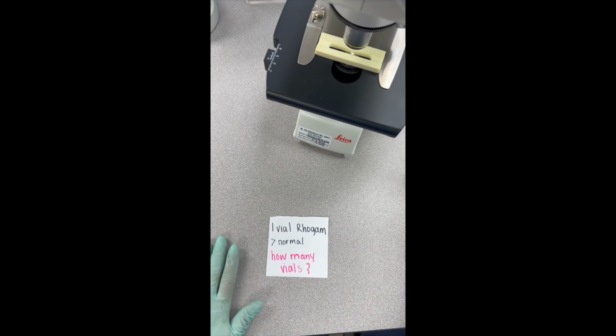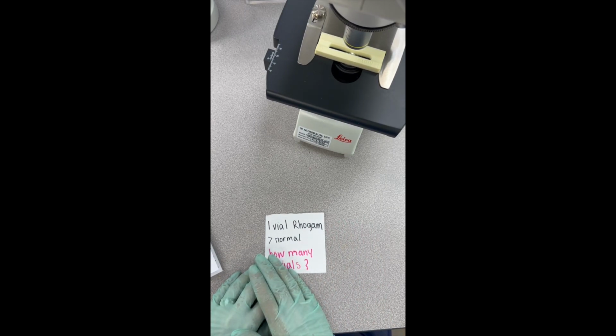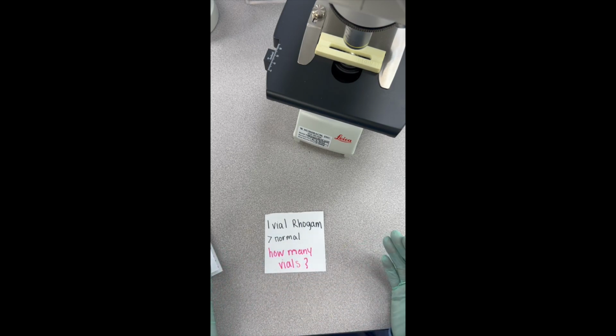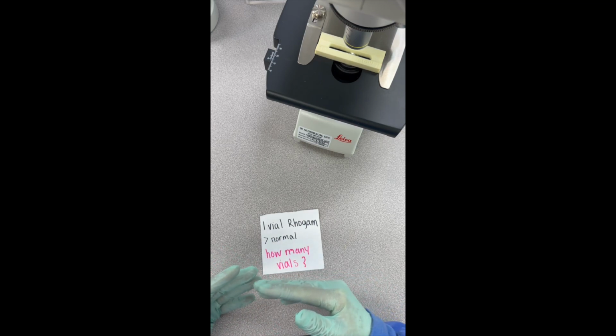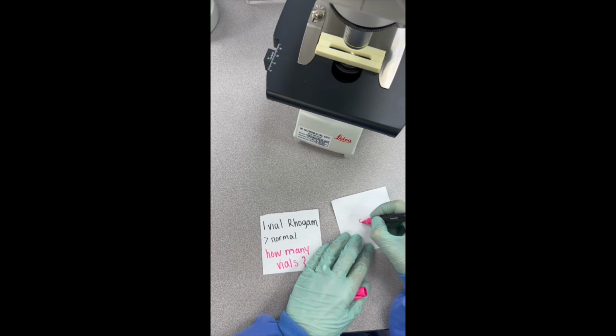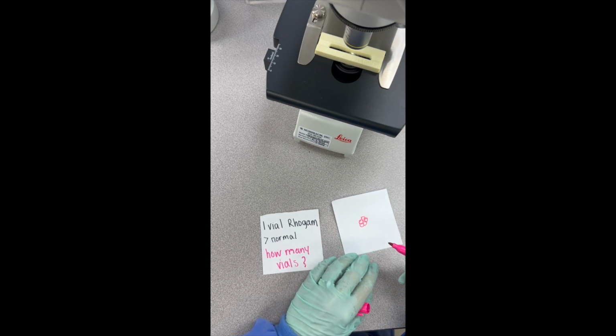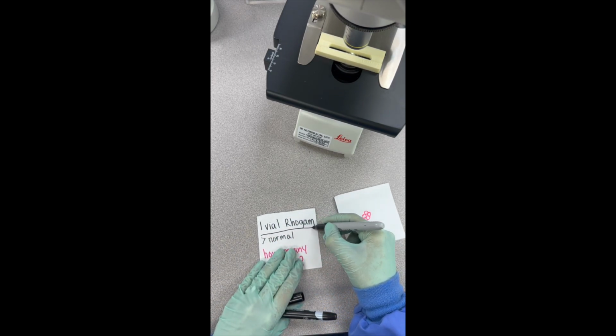Okay, so why do we do a fetal screen? That's one thing we really need to address right now. A fetal screen is utilized, remember, only for an Rh negative mom, and that's because we're looking for Rh positive cells. If we did this on an Rh positive individual, we would see positive clumps everywhere. So this is only on an Rh negative individual, and we want to see if there was a normal fetal maternal bleed. We do that by looking at 4 to 5 fields under the microscope, and if we see 4 rosettes or less, that's a normal bleed. Those rosettes, we're going to see them as little clumps like this. And under normal, we're going to give 1 vial RhoGAM to the mom, and that's good.